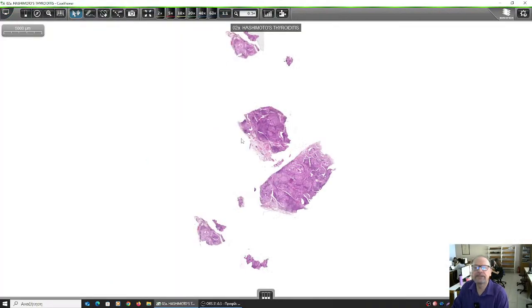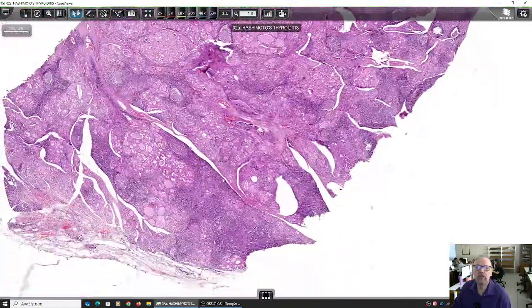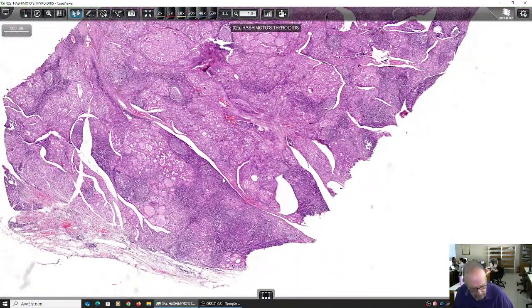The next one is an autoimmune, inflammatory lesion, and the cause of primary hypothyroidism. That means that the patient feels tired, he has gained weight. So the levels of T3 and T4 are low. However, being a primary lesion of the thyroid, what are the expected levels of TSH? They will be very high because the problem is in the thyroid itself.